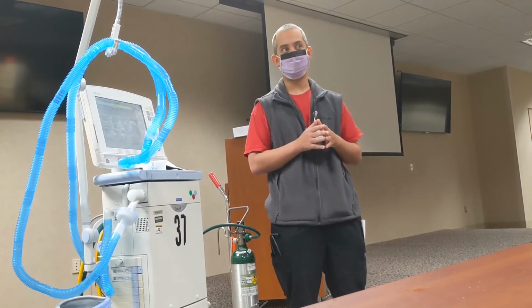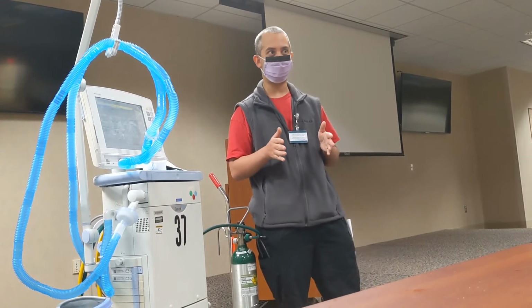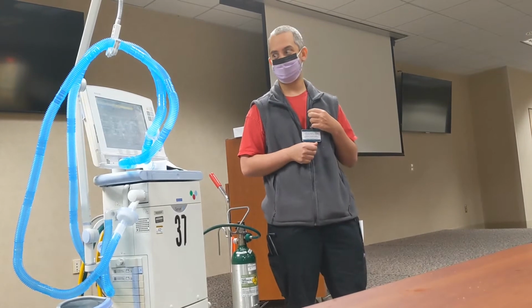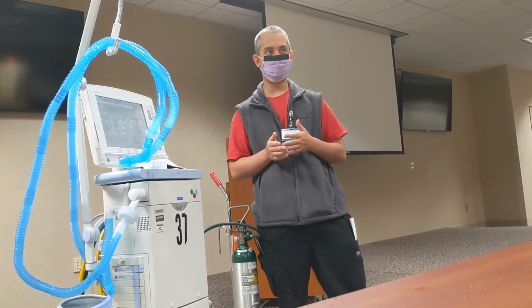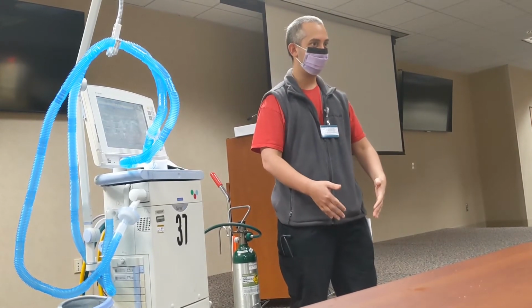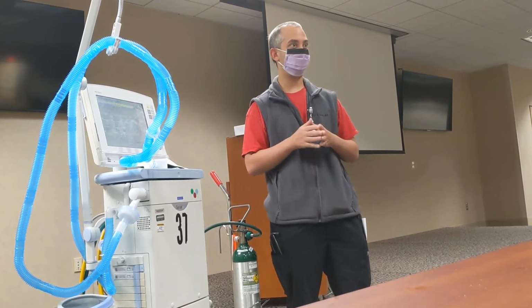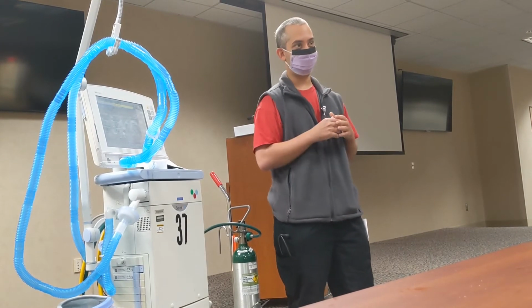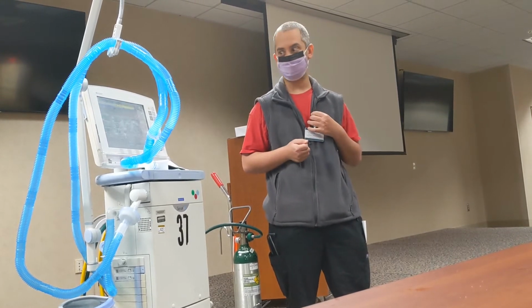And then you're also setting the time that you're at the high pressure and the time you're at the low pressure. And again, T low is one of the easier ones to set. For the average patient, it's going to be about 0.5 seconds that they're going to need to have that quick release. You don't want your T low too long because then you're defeating the purpose. If they're exhaling for a long time, you're losing all the recruitment that you're doing, and it just defeats the purpose.